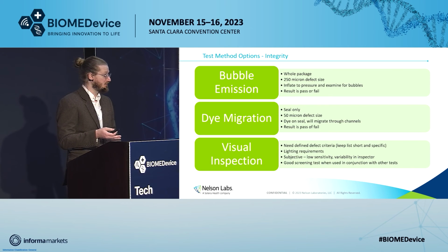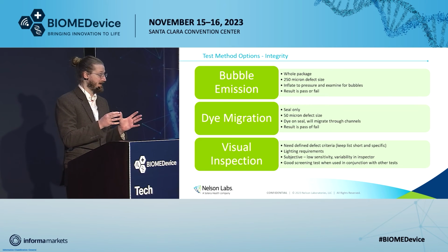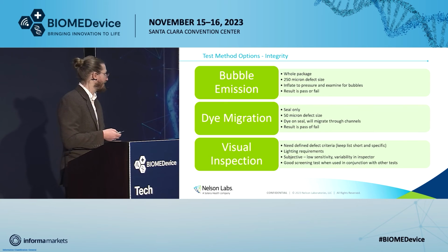When possible, it's usually more favorable to test the whole package rather than just the seal, because like we were talking about, if your device inside is moving, rubbing around, got those sharp edges, that won't be picked up by a dye test, but it will by a bubble.